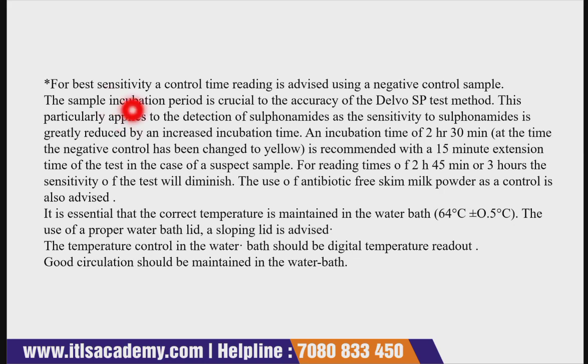This particularly applies to the detection of sulfonamides, as the sensitivity to sulfonamides is greatly reduced by increased incubation time. So an incubation time of 2 hours 30 minutes is recommended, with a 15 minute extension for the test in case of a suspect sample.